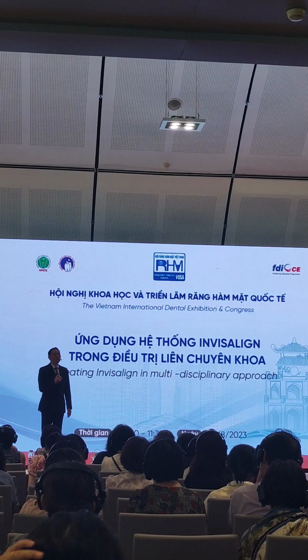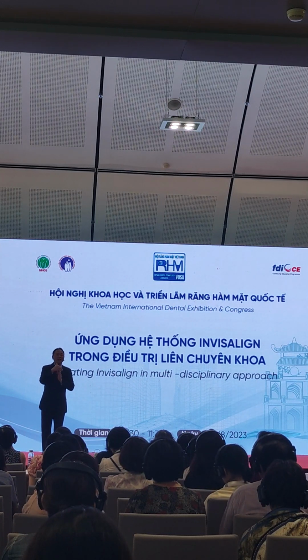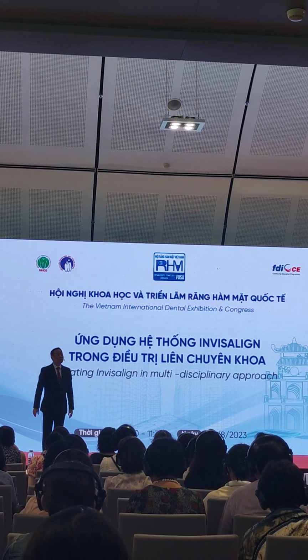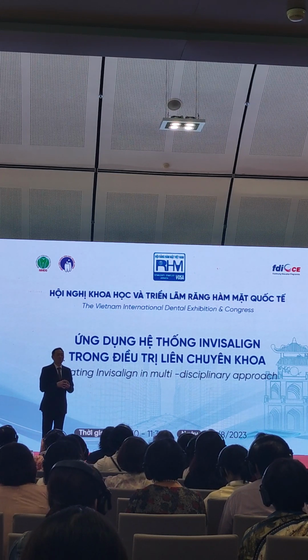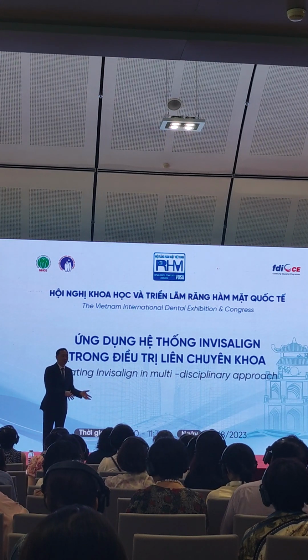So if I really want to design tooth movement to avoid that anterior premature contact, yes, I can. For example, I move one arch first, that will be very secure. But no matter how you do it, it will increase the number of stages very much. So I try to cope with it rather than avoid it. Okay.